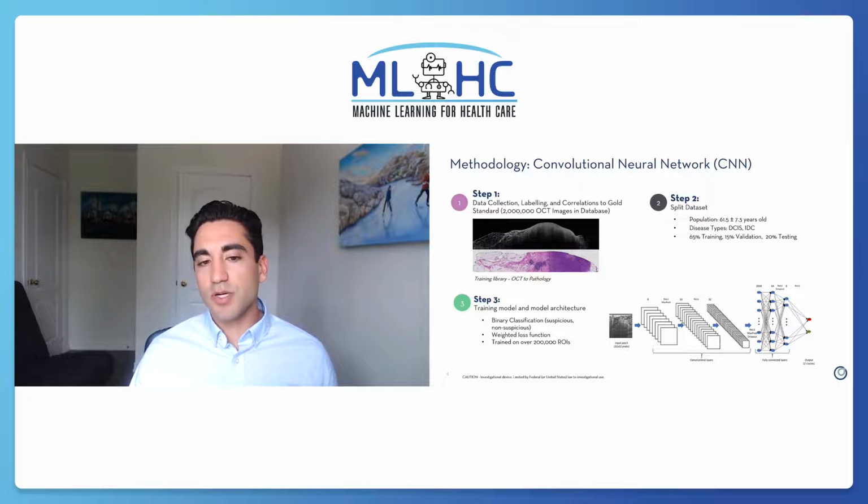The goal of this deep learning model was to be both accurate and computationally efficient to integrate into a surgical workflow and feasibly and effortlessly fit inside the cold ischemic window. This model includes 3 convolutional layers with downsampled 32 pixel patches as inputs and with a weighted loss function, which was trained and validated on over 200,000 regions of interest. These included DCIS, or ductal carcinoma in situ, and invasive carcinoma, as well as well-known mimickers.